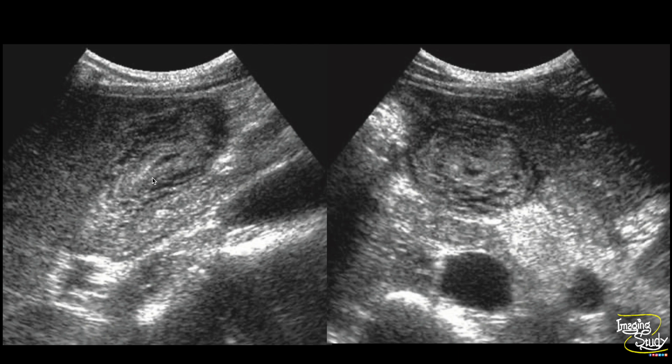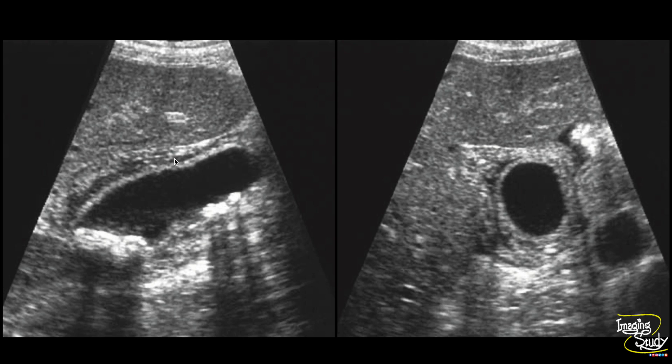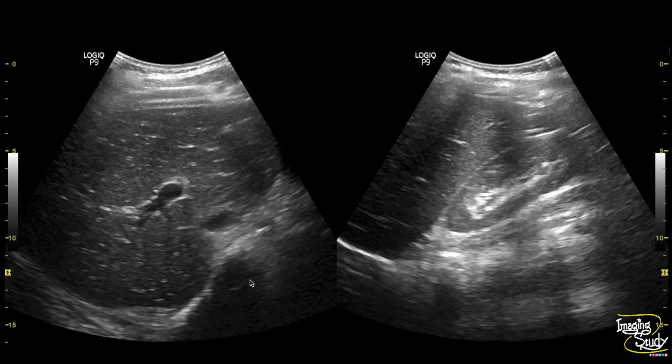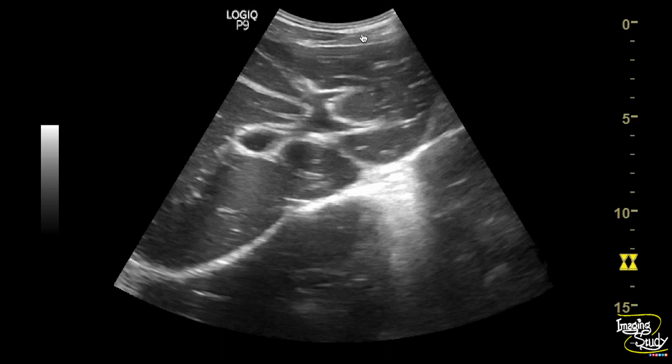On the sagittal and transverse section of the left lobe, the portal venous walls appear thickened and echogenic, indicating periportal cuffing. These pictures show the thick-walled edematous gallbladder with a multi-layered appearance and extensive hypoechoic pockets of edematous fluid. Another picture shows periportal cuffing with thickened echogenic portal venous walls and a thickened edematous gallbladder — as an incidental finding there was also cholelithiasis, which may cause confusion between cholecystitis and hepatitis. The starry sky appearance is seen in real-time scan as well.